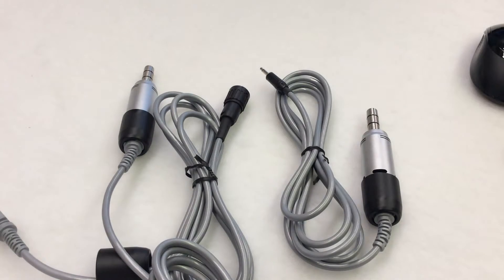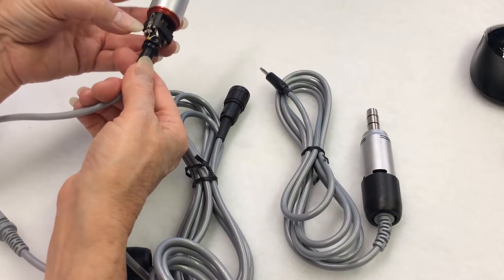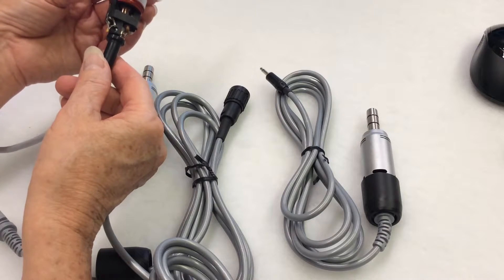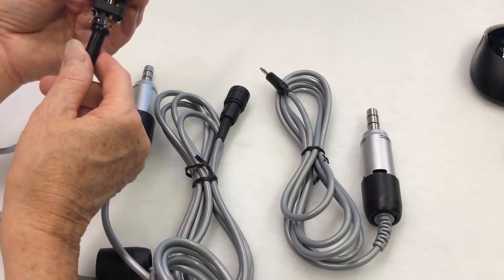Now this cord will not fit if you have this type of micromotor. See where the wires have been soldered on — this motor will not accept the quick plug-in connector. You will have to send this in for evaluation and/or repair.